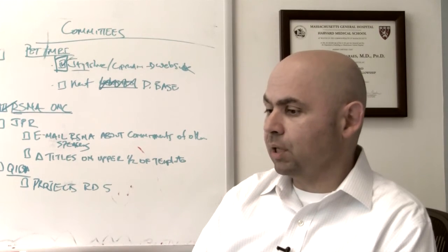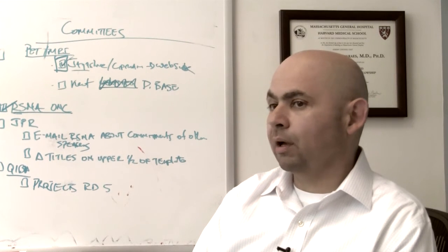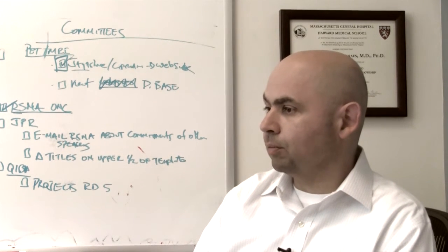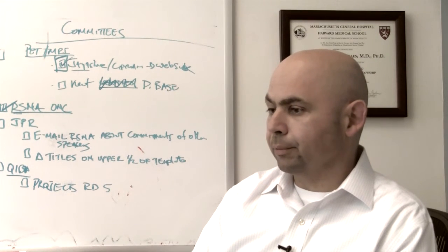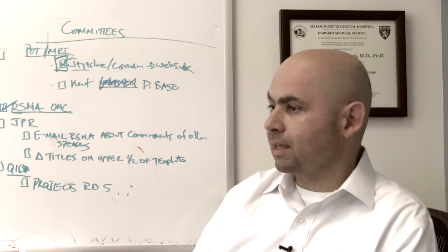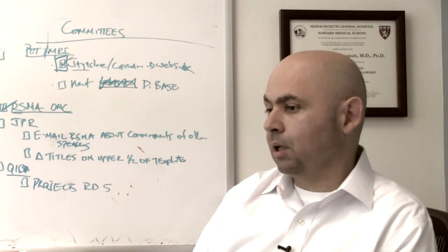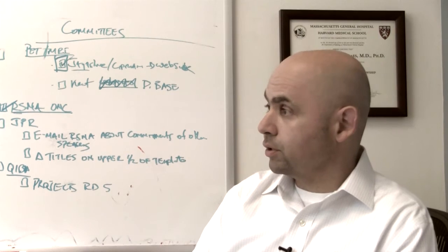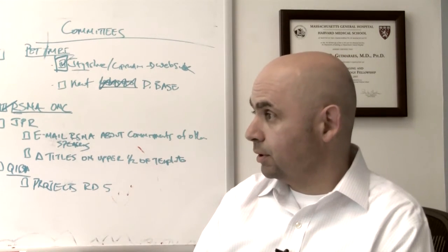It gives very high soft tissue contrast, so you have multiple functions, multiple views of imaging water. It's very sensitive to fat. It's very sensitive to various other functions. It's also very good at interrogating brain function.